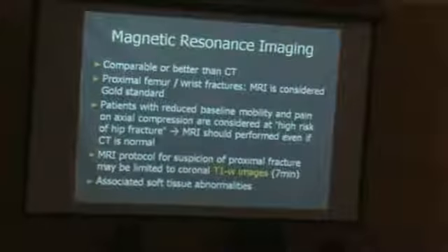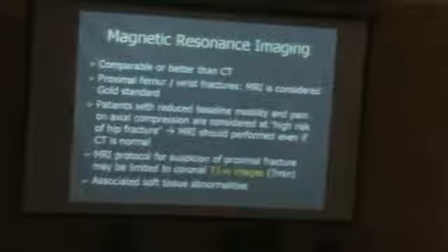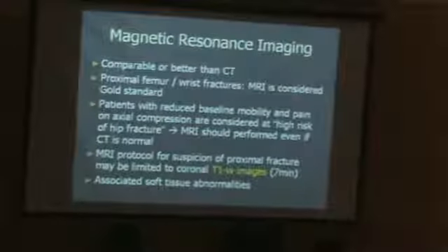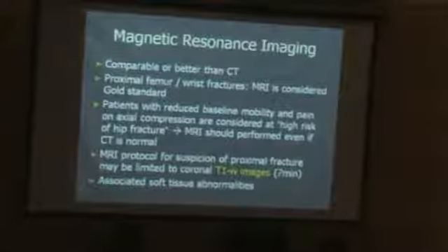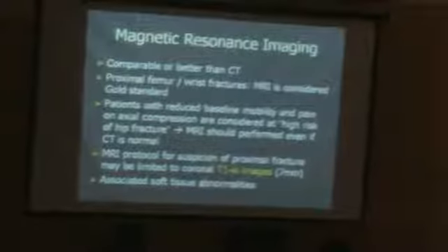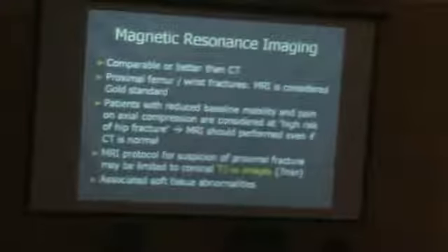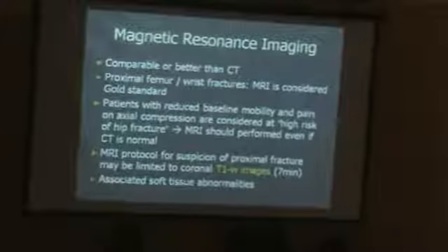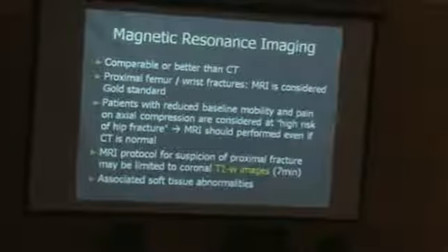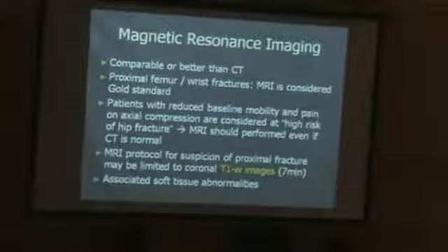Now, when it comes to magnetic resonance imaging, it is probably the best exam after the X-ray, because it shows you the whole thing, the whole spectrum. It shows you the stress fracture, the insufficiency fracture, but also the bone contusion, and of course the stress reaction. Now, very important to know as well is most of the time you cannot do it, because maybe you don't have sufficient time for the MRI. That's what happened to us as well. So patients sometimes can get in the MRI very quickly, sometimes cannot get to the MRI.